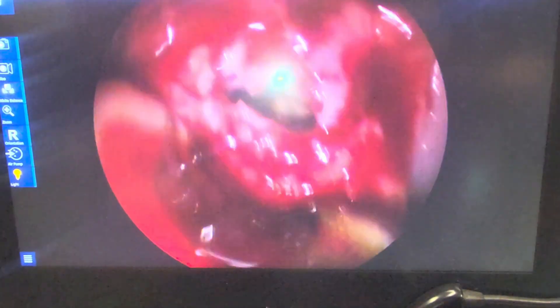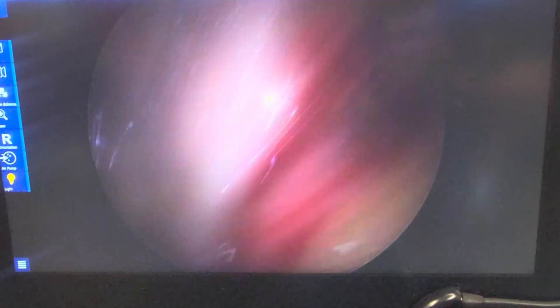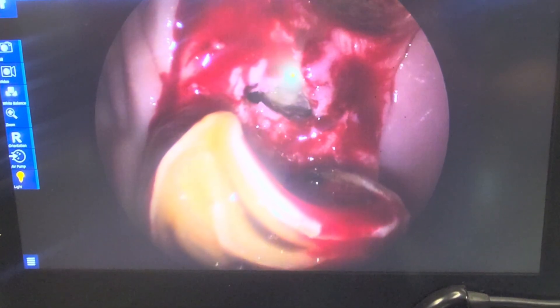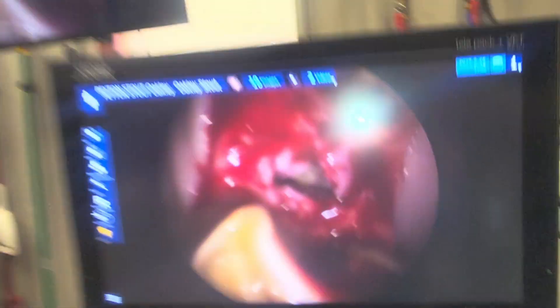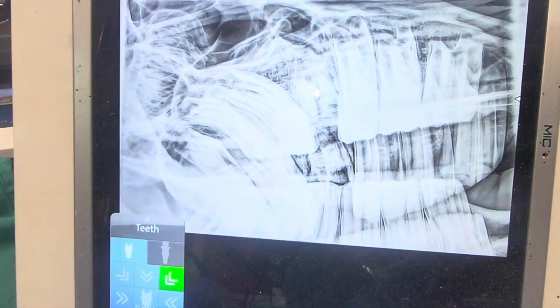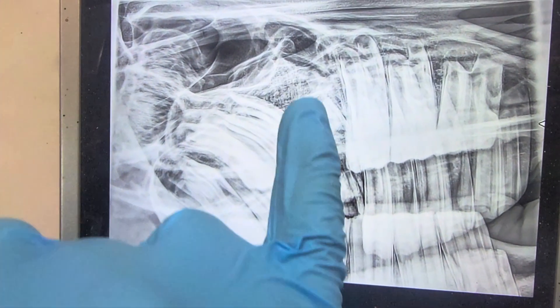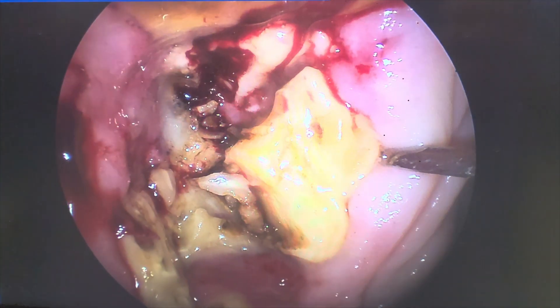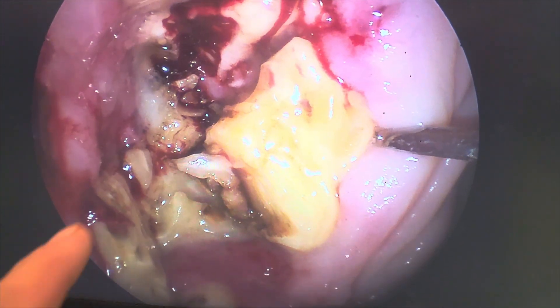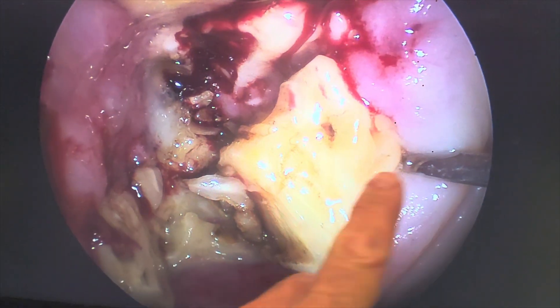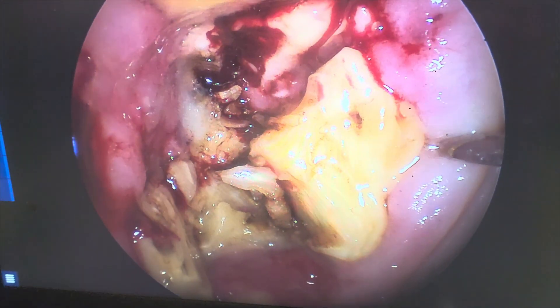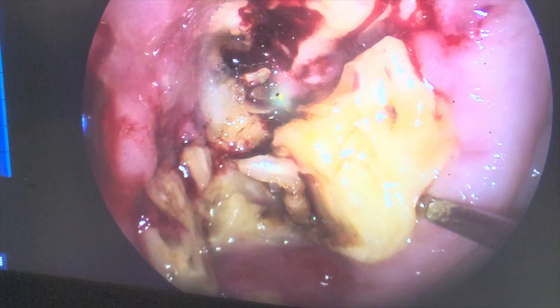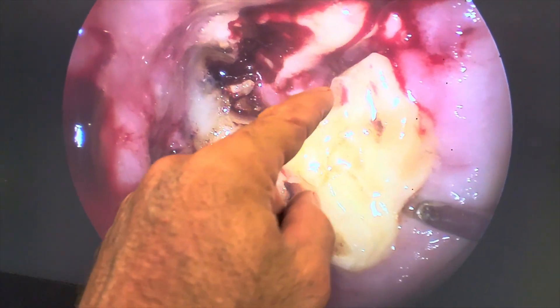We've drilled into the tooth and we're actually cutting it into pieces. On the x-ray you can see where we made a cut and how we've lined up that cut, so now we're going to go ahead and pick these pieces out. We've got one tooth out right now and we're starting to work on the other one. You can see pus coming down — we're working with periotomes, cutting down the periodontal ligaments — and you can see the pus oozing and coming down from the infection with this tooth.